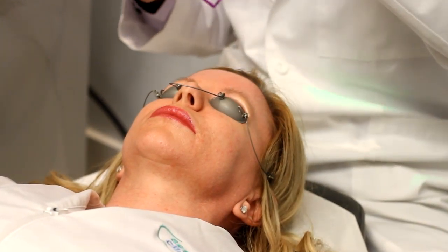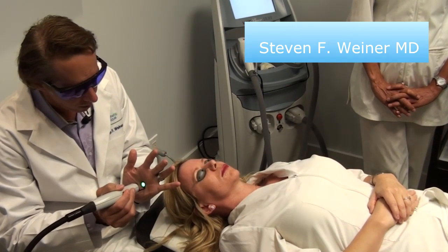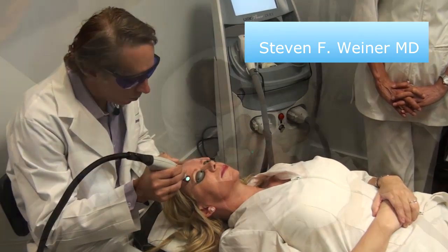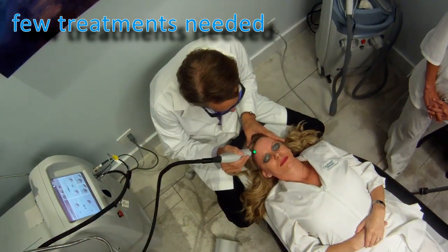It's a very bright laser, and as I mentioned, it fires out the cryogen at the exact same time. So here we'll demonstrate it on the skin.